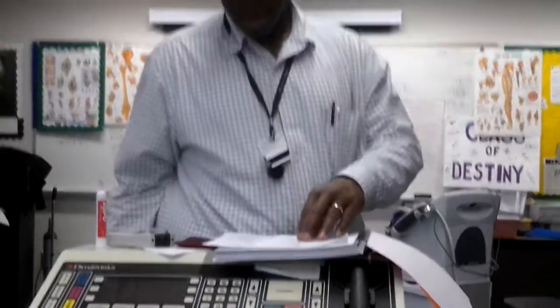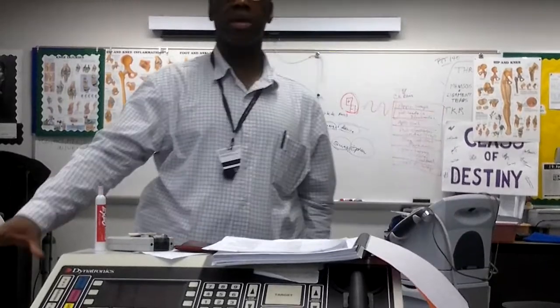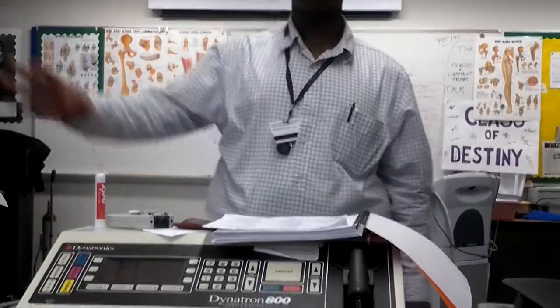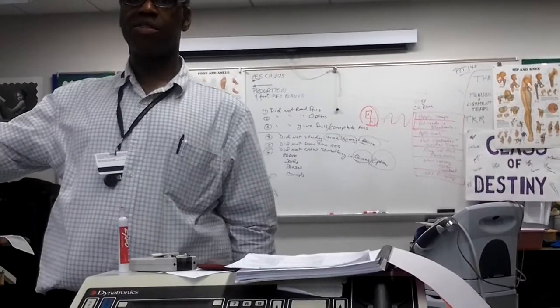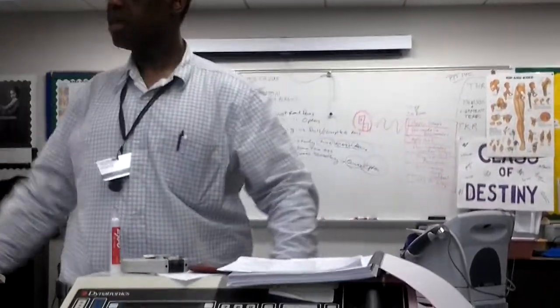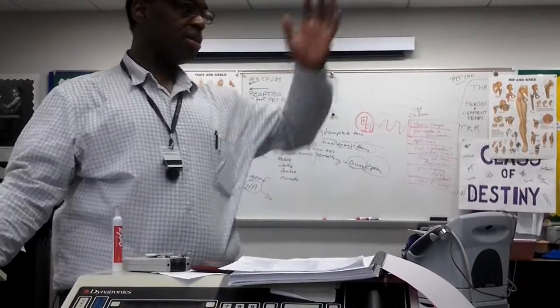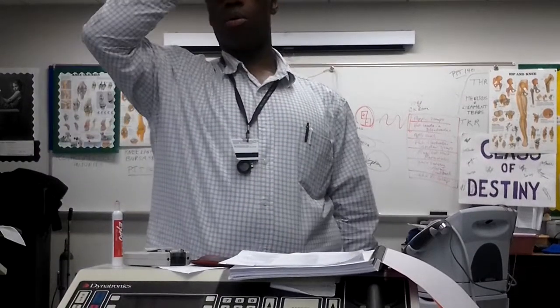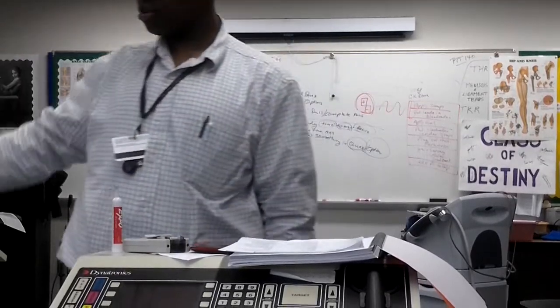All right, so low frequency, medium frequency, high frequency. We looked at that on the second page. So low frequency is 0.1 up to 1,000 hertz, cycles per second, whatever. And then 1,001 to 10,000 hertz is medium frequency. And then 10,001 and up is high. So low is TENS, E-Stim, medium is Russian, interferential, or polyphasic, and then high is ultrasound, laser, if we ever get to that.